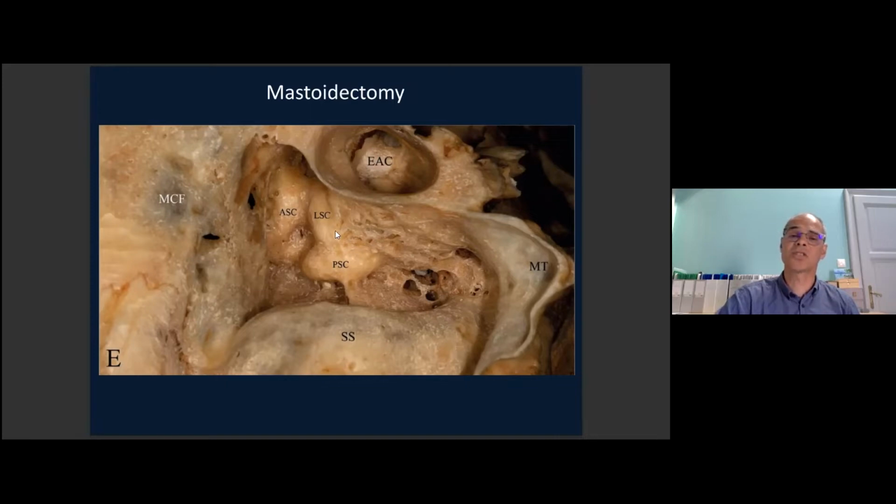This is not just a hole in the mastoid process. If you would like to make a good mastoidectomy, you should learn the skeletonization. Skeletonization of the middle cranial fossa means just to leave a very thin bony shell around the temporal lobe, so the brain itself. You can find here just a bony plate without any air-filled remnants.